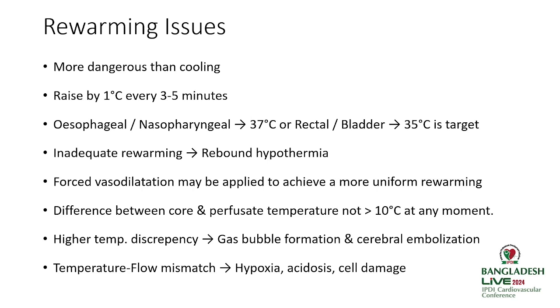So after that, you finish your surgery, you close your heart, then there is rewarming, which is more dangerous than cooling, because if you put a bottle of Coke outside, what do we see in the heat? Once you open it up, it fizzes up. That means the lower the temperature, the more soluble the gases are in it.